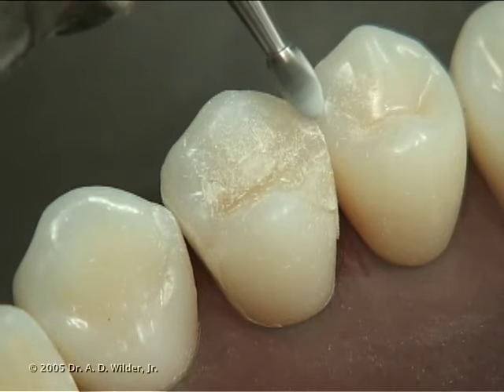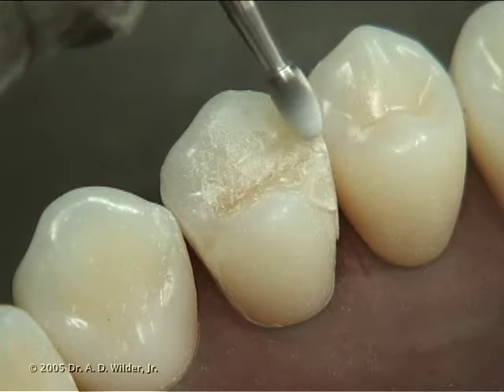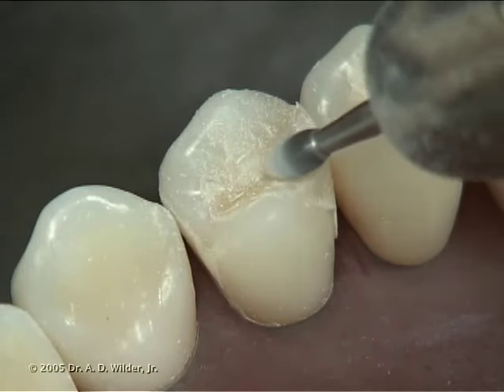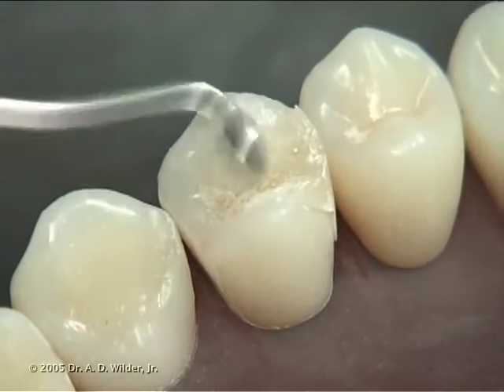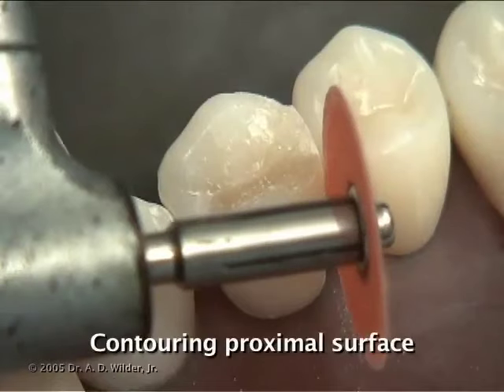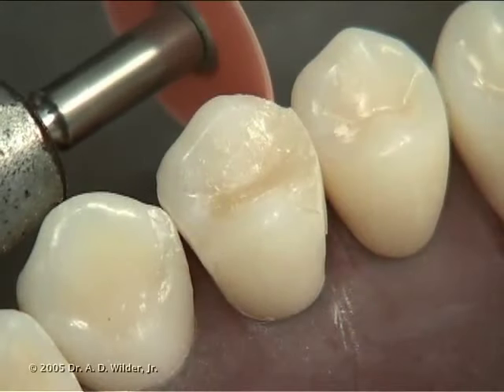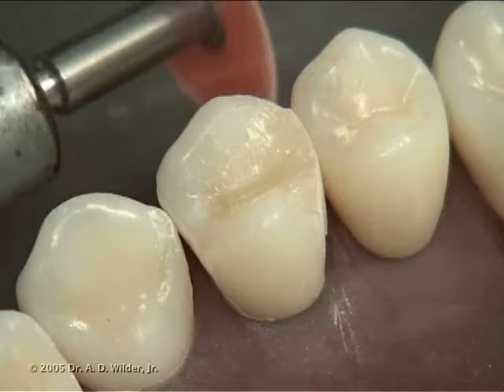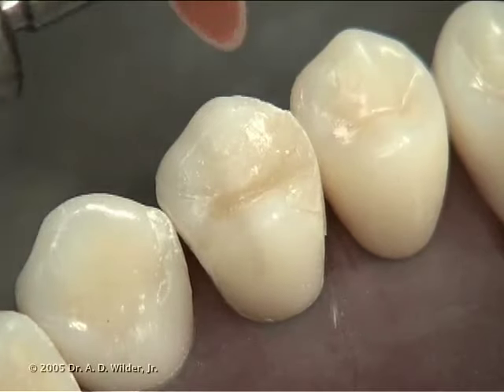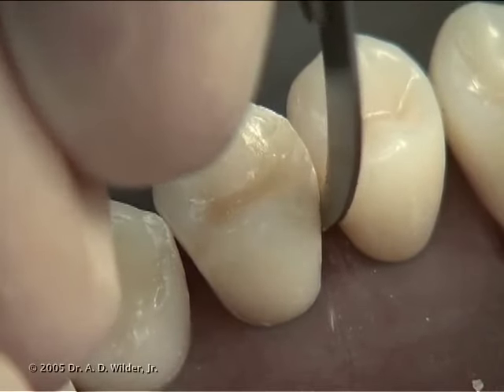You can carefully recreate the occlusal embrasure with the finishing burr as well. Soflex discs are excellent for contouring the proximal surfaces and recreating the embrasures. If access is difficult, you can use a narrow, flame-shaped finishing burr. A number 12 scalpel blade, or even an amalgam knife, can be used to remove excess composite at the margins.